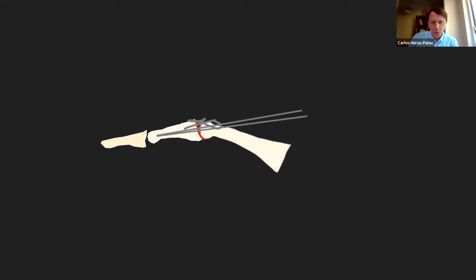And then the next thing is to get the 2K wires correct and flush. It's very difficult to bend this wire down onto the bone. So the thing to do is you bend it upwards by the same angle or more than there is between the wire and the bone. When you bend it up, cut it, and then rotate it 180 degrees while you're pushing in. And we'll get really flush with the bone, then do the same with the other one, and that's your construct.